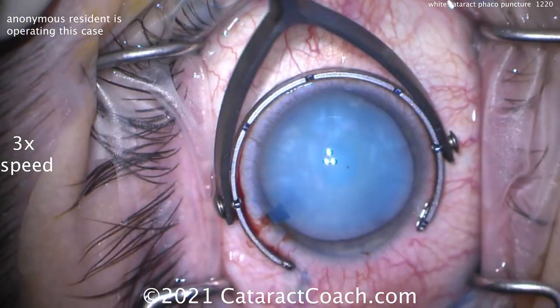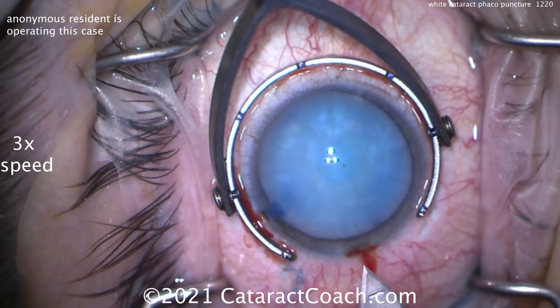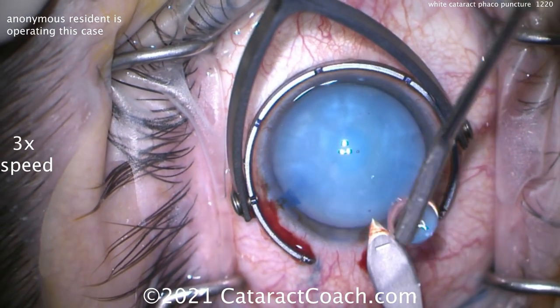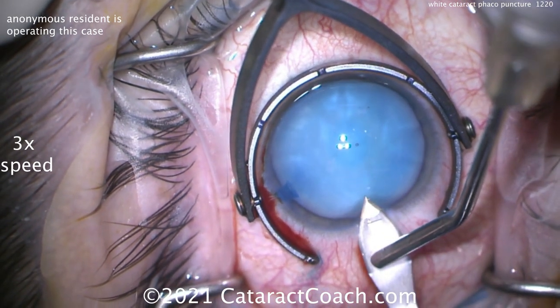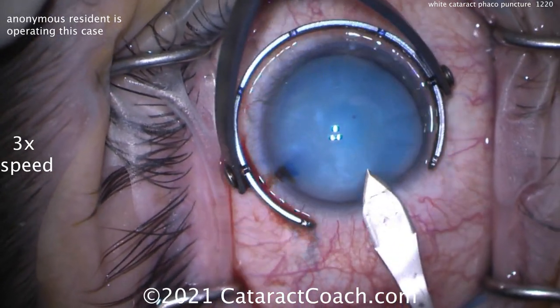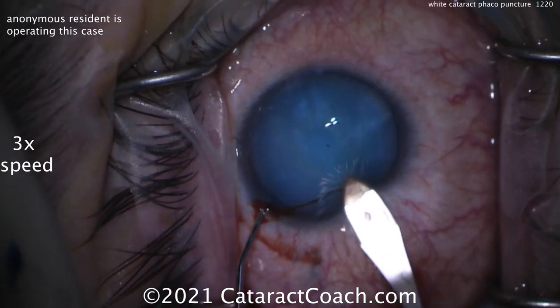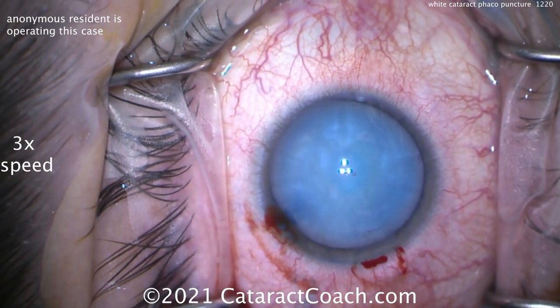We're going to make the main incision here and buzz in with the FACO probe. Now the other option here is you can do a double rhexis technique — make a little baby rhexis through a paracentesis while keeping the AC highly pressurized. So we're going to make a nice incision here, guiding the resident to make sure it goes in beautifully. We're going to use the FACO probe with a very high infusion pressure, up to about 90 millimeters of mercury.